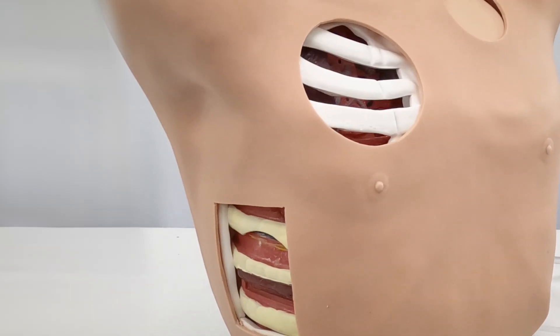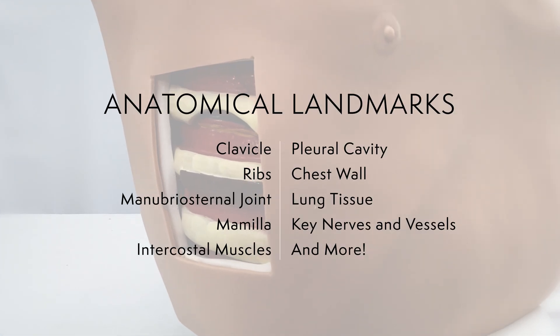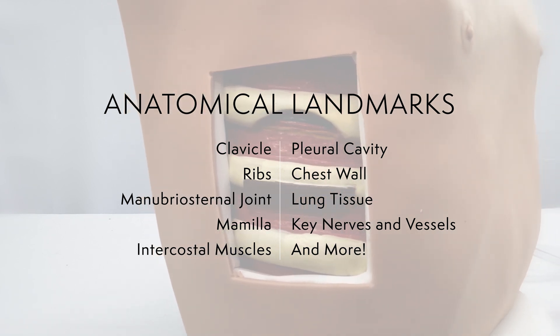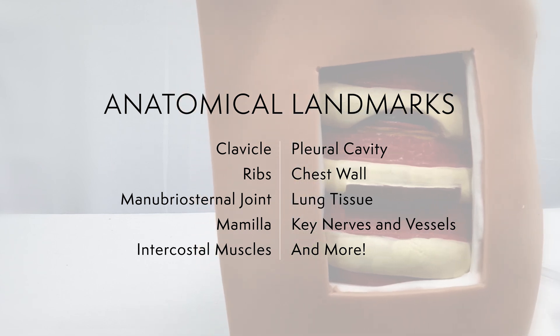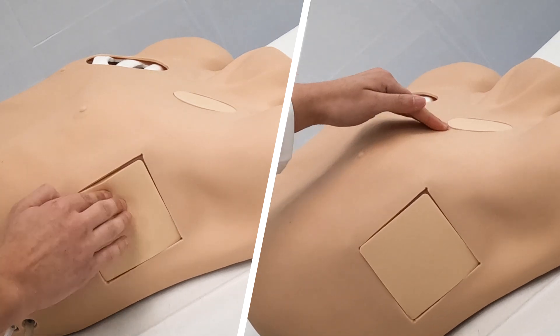The model presents an open visual window of the anatomical landmarks, including the clavicle, ribs, manubrio-sternal joint, mammilla, pleural cavity, chest wall, muscle, as well as key nerves and vessels through an open window. This design creates a reference for accurate palpation on the opposite side.